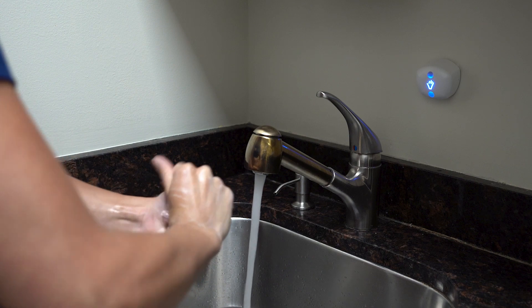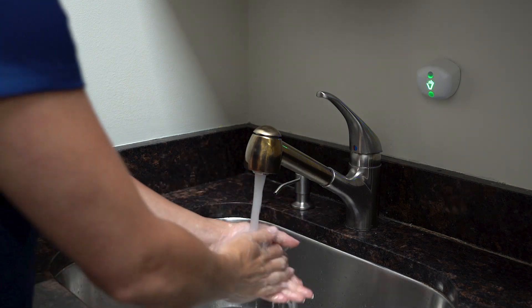BioVigil is on a mission to save lives. The way we save lives is by improving hand hygiene in healthcare settings so that infections can be as low as possible. We are the market leaders because we have the best innovation in the marketplace. AccuWash technology is going to take innovation around washing hands at a sink to the next level. If you want to know more about BioVigil, AccuWash technology, and any other technology innovation that we have, visit our website.